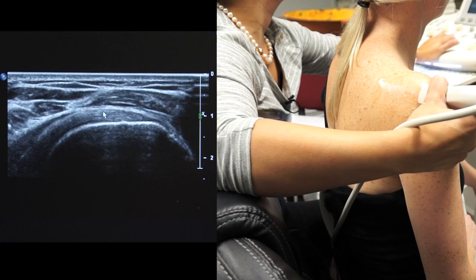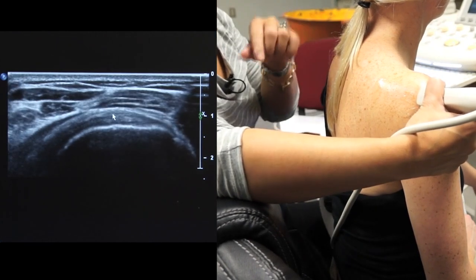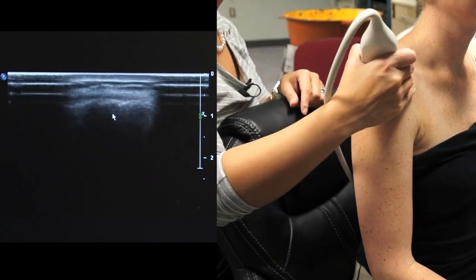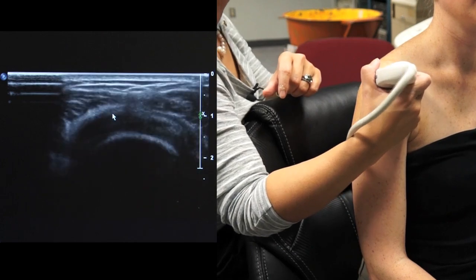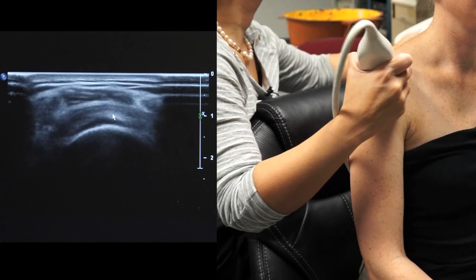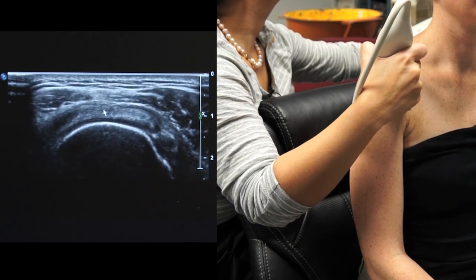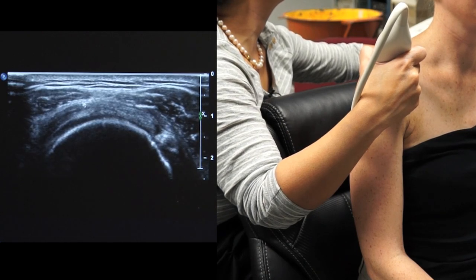Now, anytime you image the tendons in long axis, you want to also image them in short axis. So we just turn 90 degrees from where we were. The transducer is to the patient's right. The marker is to the patient's right. And then we can look at the humeral head, the cartilage, and the rotator cuff. Okay, and then the deltoid is on top, and the subacromial subdeltoid bursa is in between.